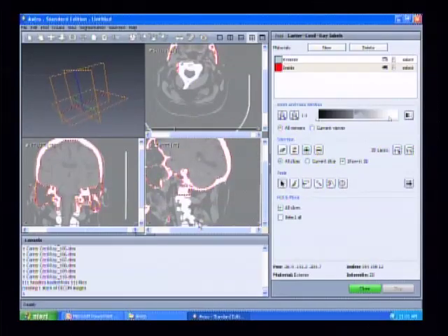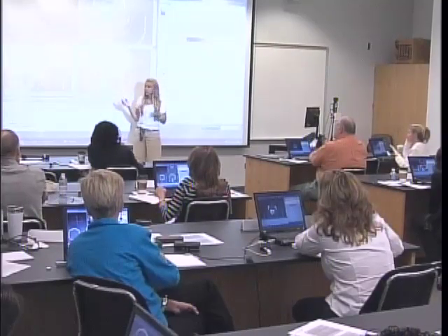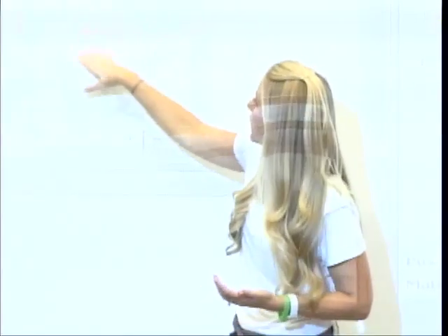So this is where it's very difficult, and this is where your paintbrush will probably have to come into play, when you have these edges that are just continuous. You would have to come in, using your knowledge of anatomy, and make the decision on what's vertebral body and what's the cranium. So when it comes to this very general area, that's when you would use your paintbrush to be a little more specific and go through. Does that make sense?